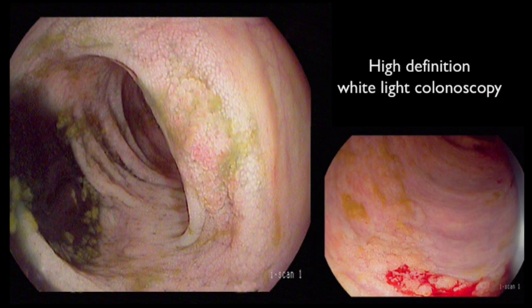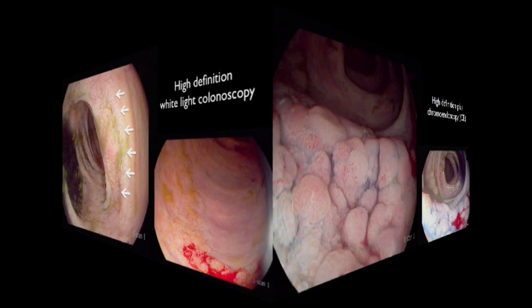This case demonstrates the additional value of chromoendoscopy for clinical decision-making in IBD surveillance. This patient with long-standing ulcerative colitis underwent surveillance colonoscopy. At first examination, using high-definition white light endoscopy, a subtle appearing flat elevated lesion was observed.